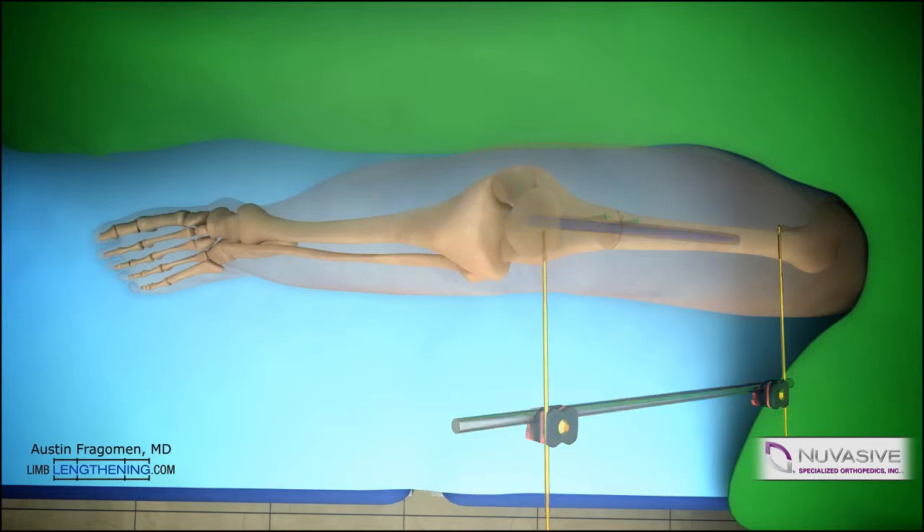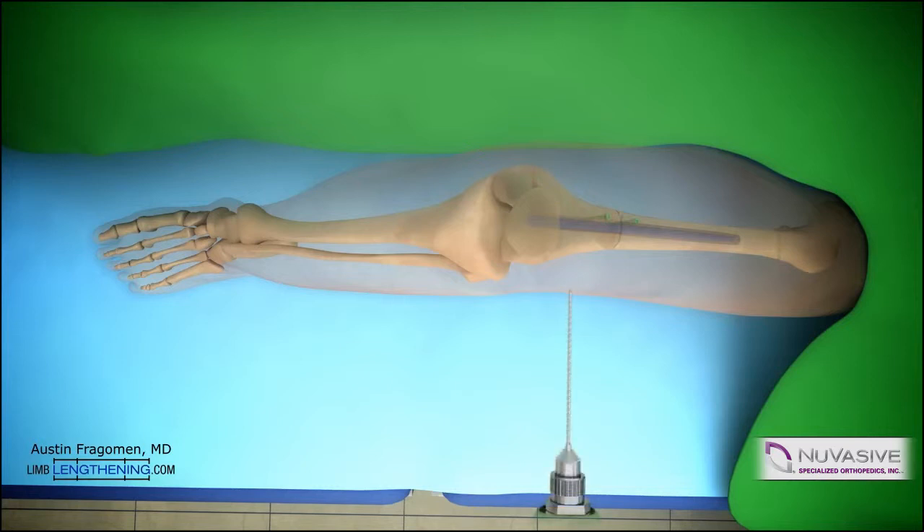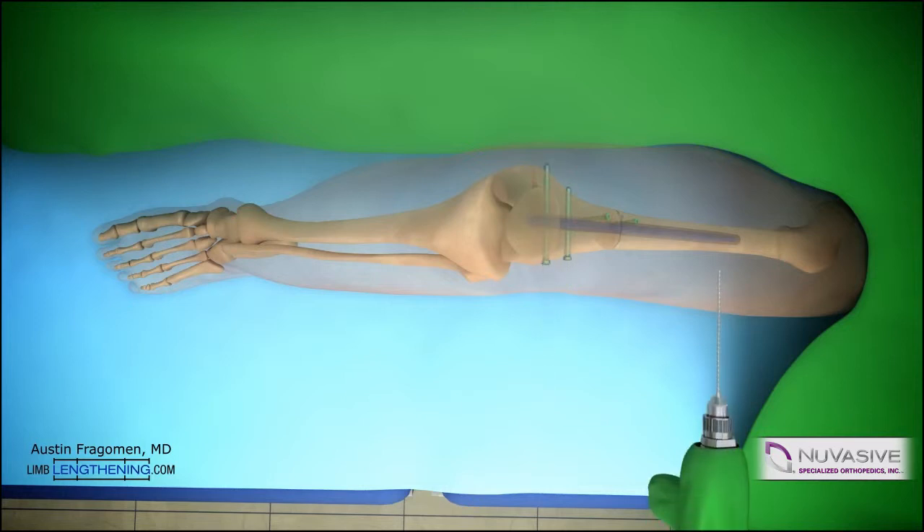Distal locking is then performed using the included targeting device. After locking distally, the rotation should be checked once again and held in the desired position. Then proximal locking can be done using the perfect circle technique and fluoroscopy. Note that the nail passes just lateral to the blocking screws, locking this into the desired alignment.